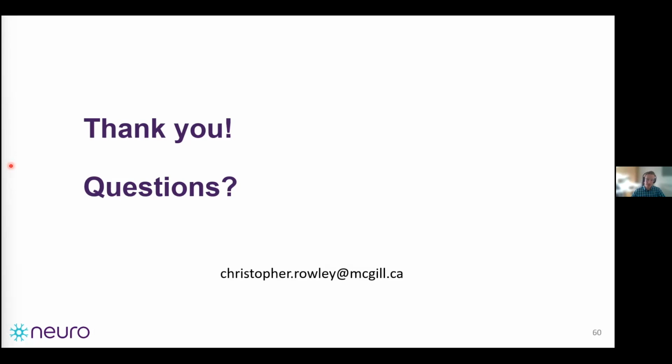For correcting MT work, the paper, it's a little bit more complicated. There's a lot of simulations that go on, and then correlating the simulations to imaging data. But if people are interested in doing that and they're not quite sure what's going on, I can definitely help them out. But it's all on a GitHub that's referenced in the paper, and I think I laid it out fairly straightforward. But definitely T1 mapping is pretty straightforward. It's just how it's calculated, whether you're just multiplying the flip angles by your B1 map.